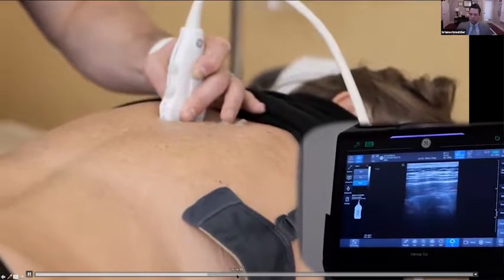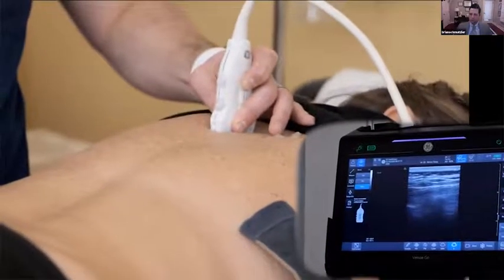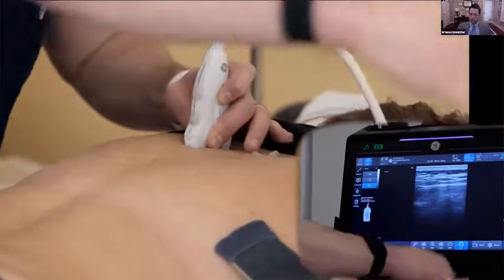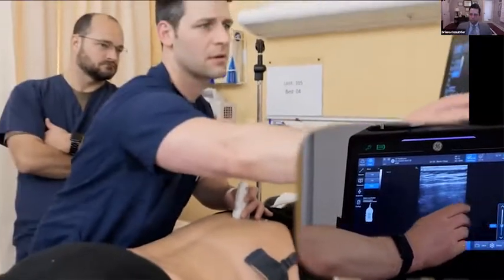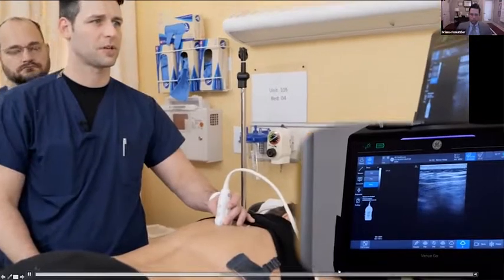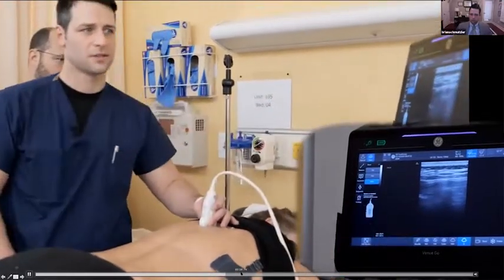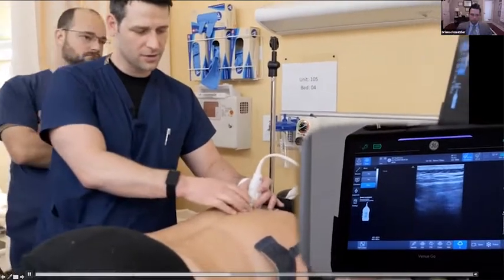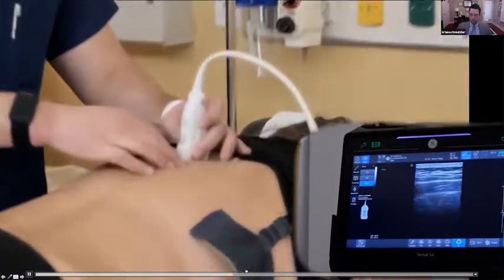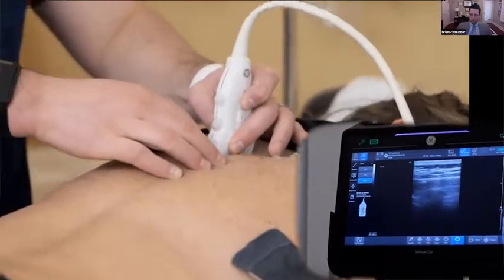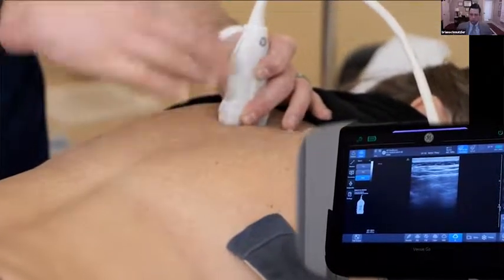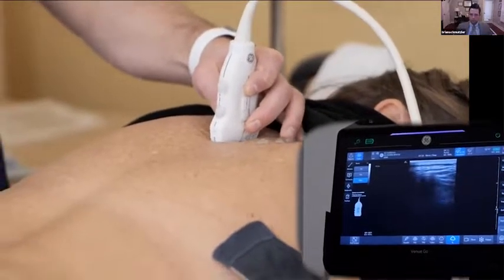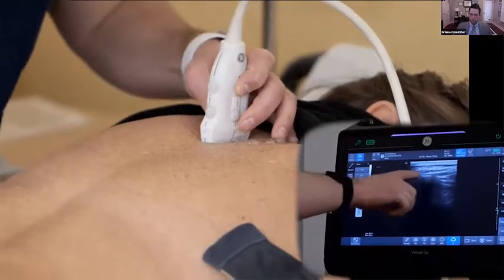If you slide even more laterally, you end up on the rib and can see the pleura underneath. Ask the patient to take a big deep breath and you can see the pleura move — that means you're too far lateral. It's subtle; going from transverse process to rib is not very far. I'll do both sides from the same side, so I'll just come back to the spinous process. There it is — a big white line representing the spinous process.